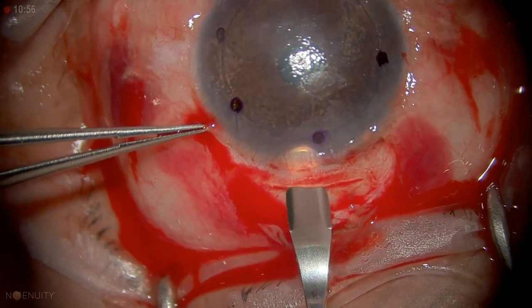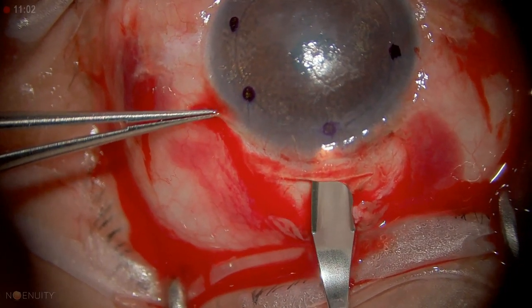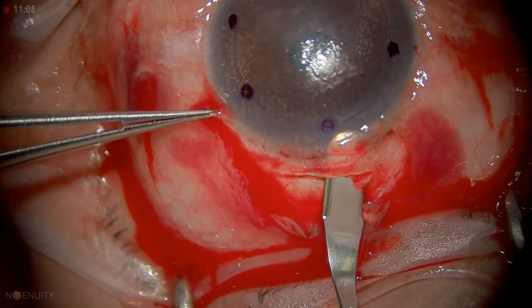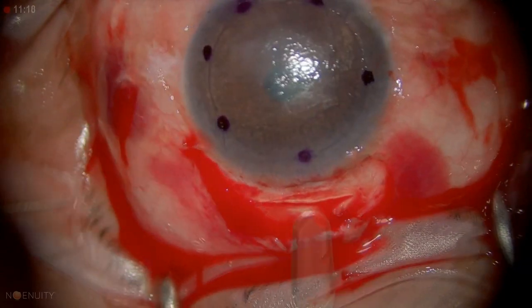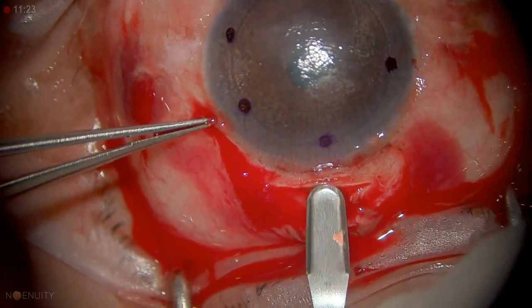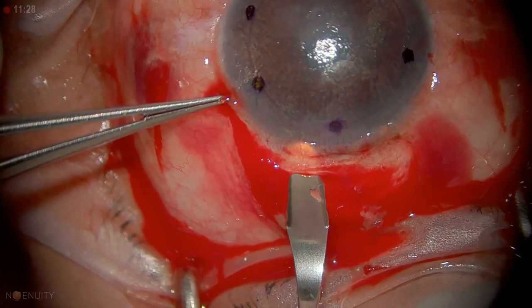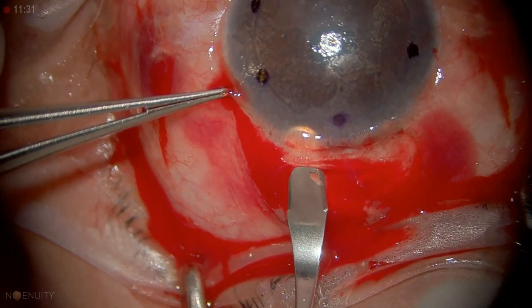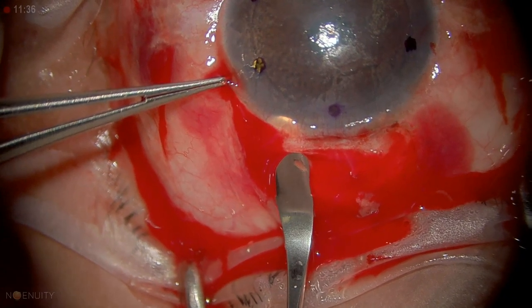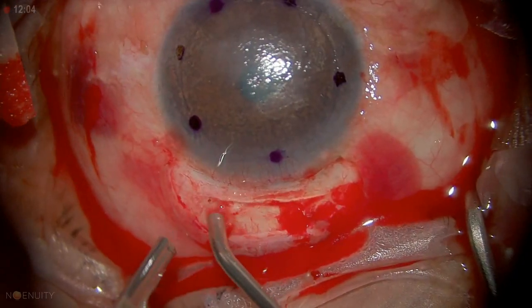When I need to go back, I cut going backwards so that I stay in the same tunnel. I always go back in the same groove — I fixate the eye, enter again, I'm in my same groove, cutting as I go back, then wiggle forward just a little bit, always keeping the base of that. I can tell I'm at a good depth here because I'm pretty deep in the cornea, maintaining a nice plane. So now we have our plane of dissection.